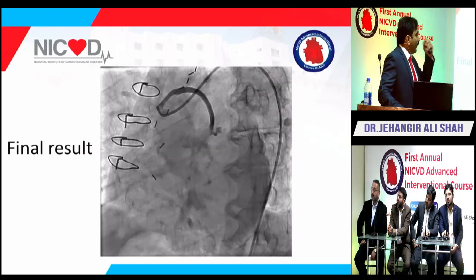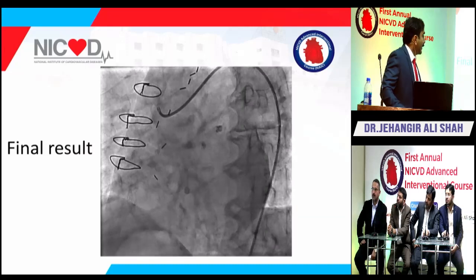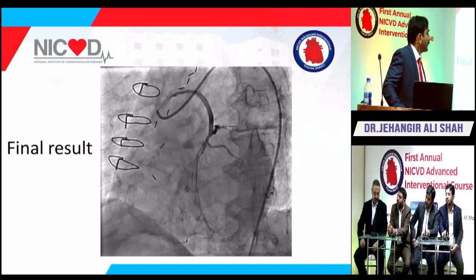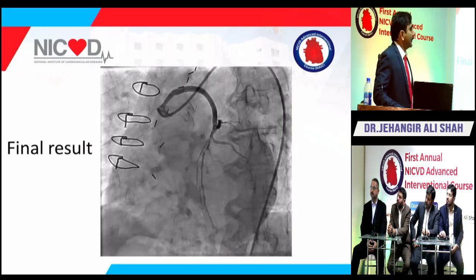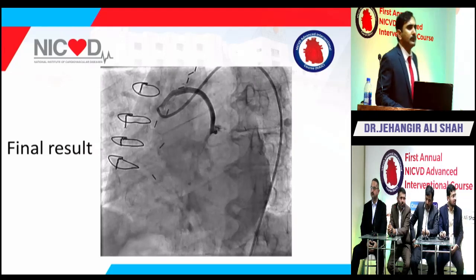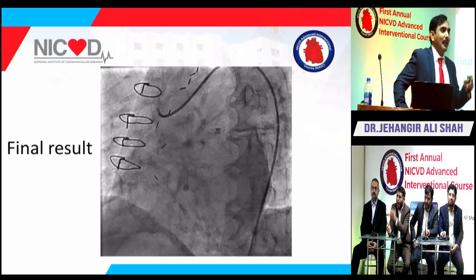So this is the takeoff angle. It was very difficult. At one time I just engaged the ostium of the SVG. So these are the final results. 4.0 by 8 NC at 18 atmospheres.